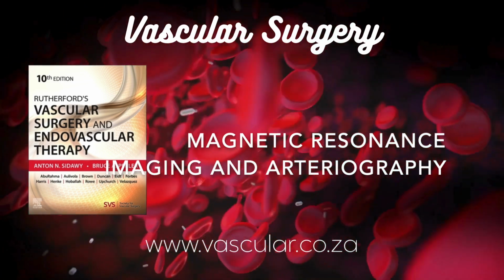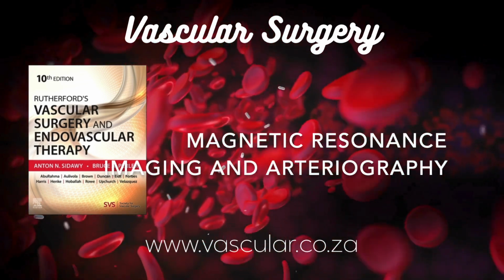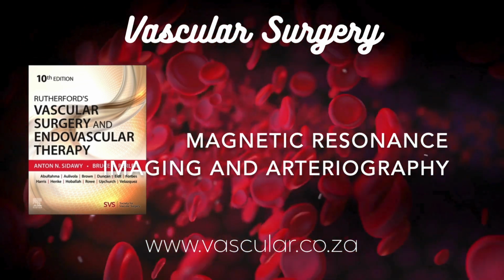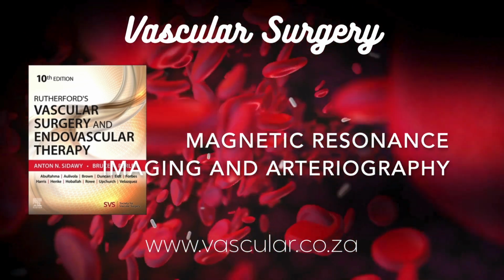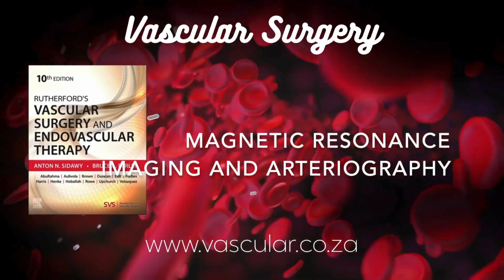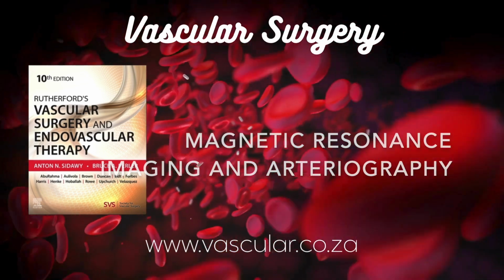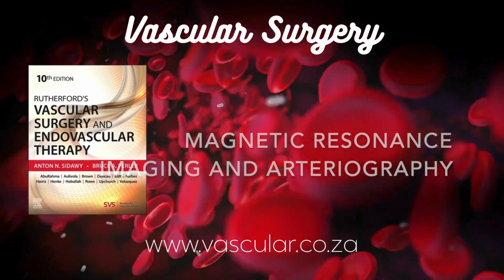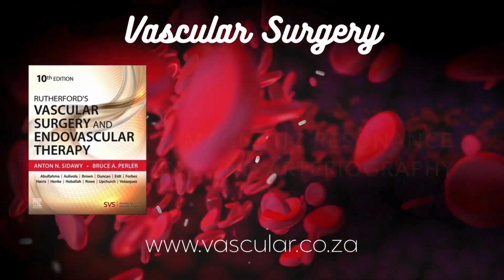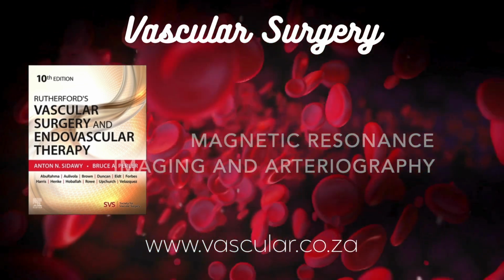Step table MRA does just that. It images different anatomical segments sequentially. The MRI table physically moves the patient between these stations. Like taking separate pictures of the thighs, then the calves, then the feet. Precisely. So maybe station 1 is the abdomen pelvis, station 2 is the thighs, station 3 the calves, and so on. Each station gets positioned optimally in the magnet center. And you can optimize settings for each part. Yes, you can use different coils, different field of view settings, resolution, orientation, tailor it for the anatomy in that specific region.